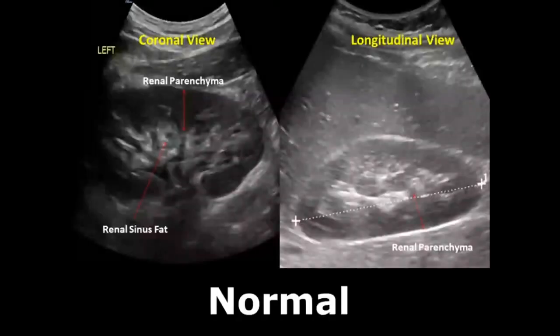Hello everyone, this is Dr. Sam, and today we will talk about kidney ultrasound: normal and abnormal appearances. We will do a comparison between the normal and abnormal appearances. We start off with the normal views.